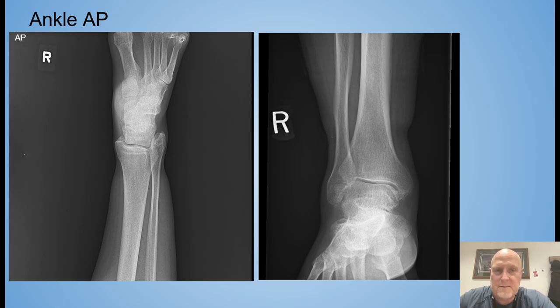Remember, it's just like that patient looking at us, like we're looking at his ankle while he's standing there, he or she. So we've got the one on the left, it's upside down. We've got the one on the right, and it is done correctly. It's annotated correctly. It looks anatomically correct. Contrast-wise, this is a really nice image. Joint spaces are well preserved. We can see difference in densities, bony cortical. We can see everything that we need to see. It just needs to be hung correctly.